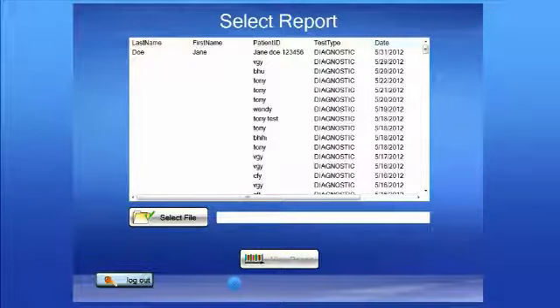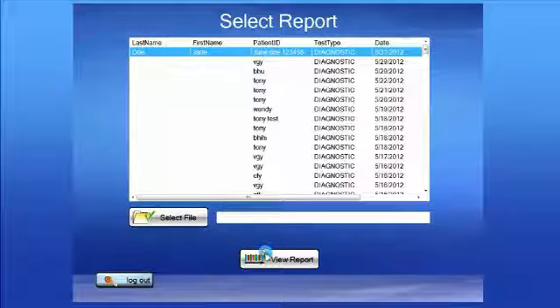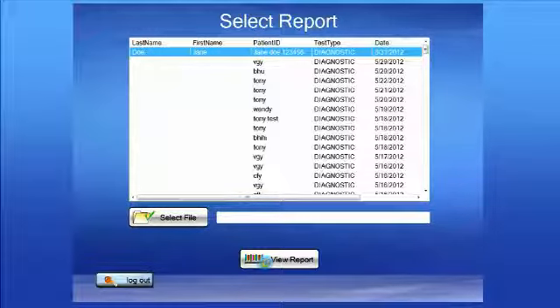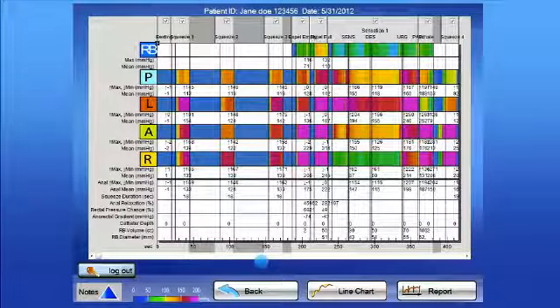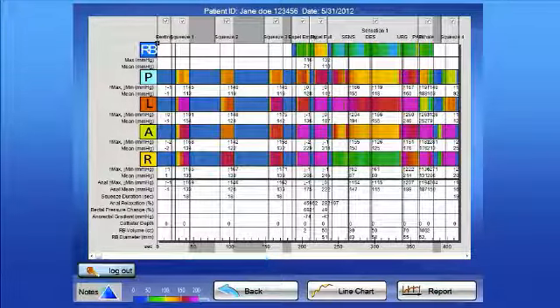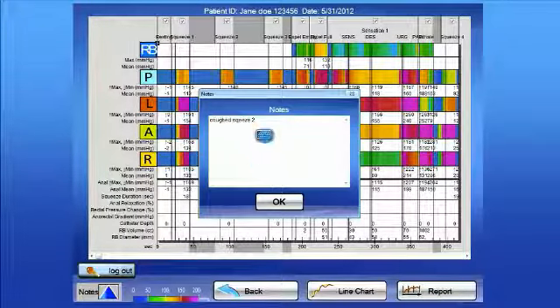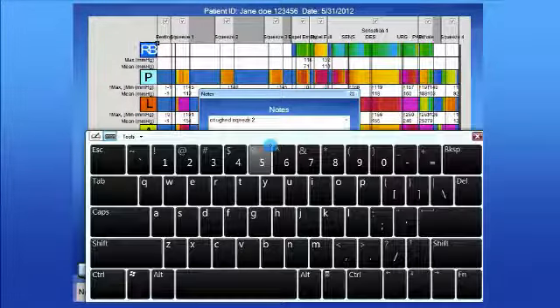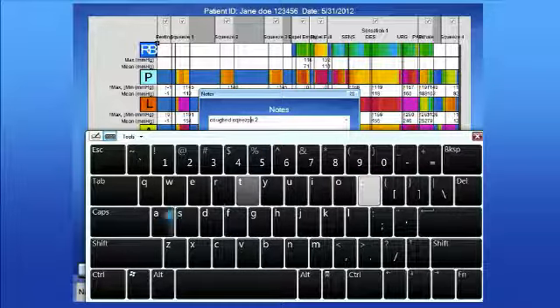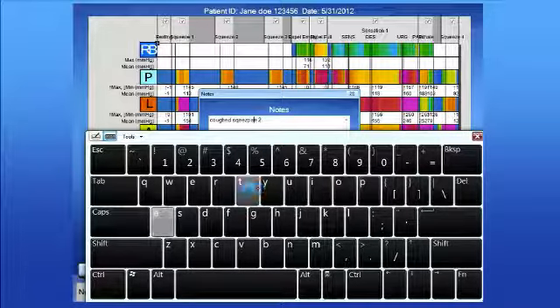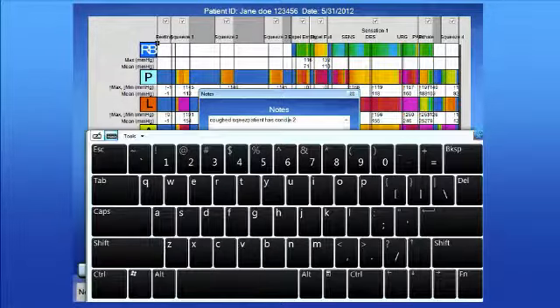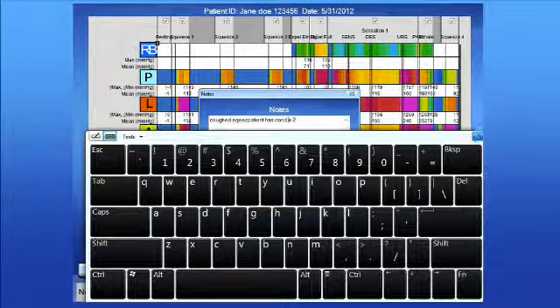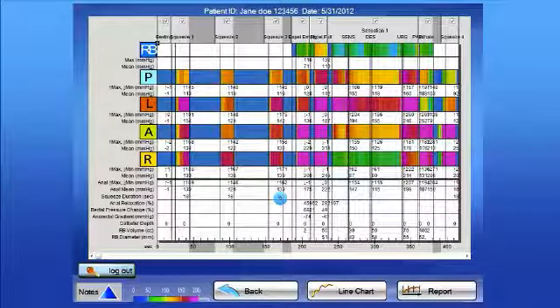If you need to add a note or impression to a file, you want to make sure that you save the file when you're in that section. In this example, we would tap view report and the report will be generated. You may at this time add your note or impression to the report. For this example, we will simply state that the patient has a condition. Once you've added your note, tap the OK button.